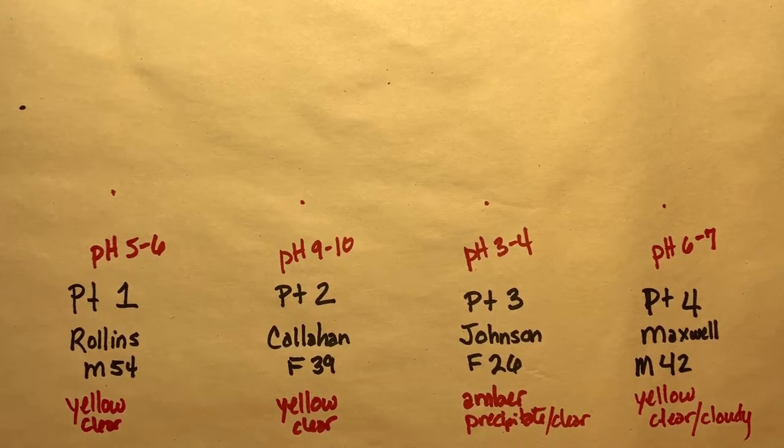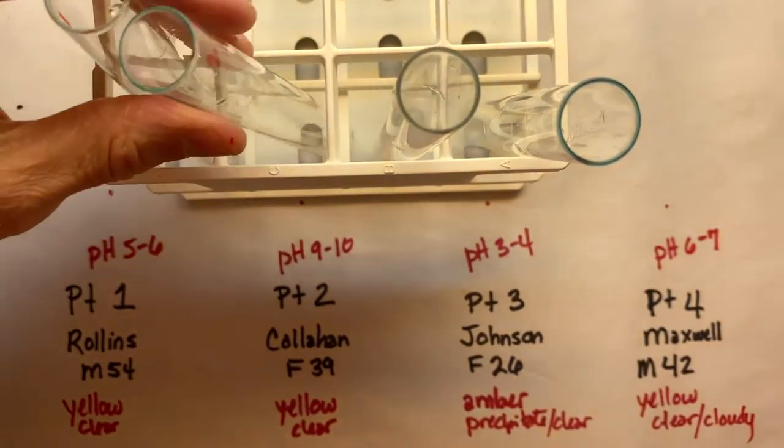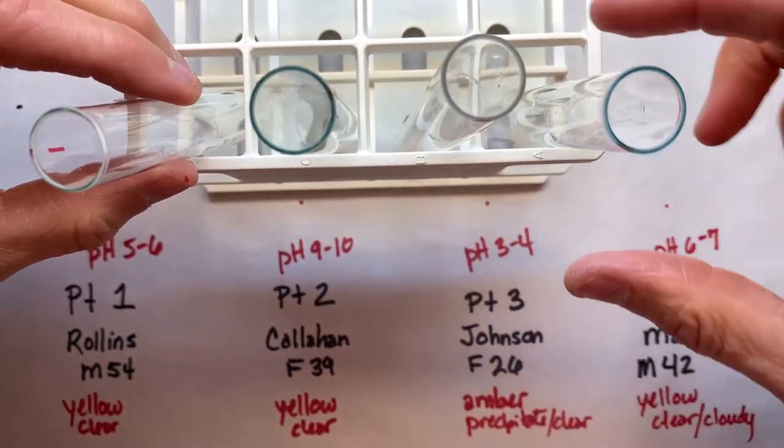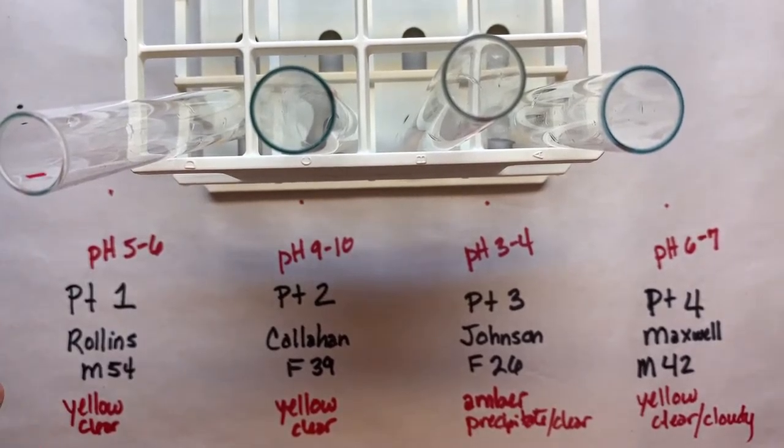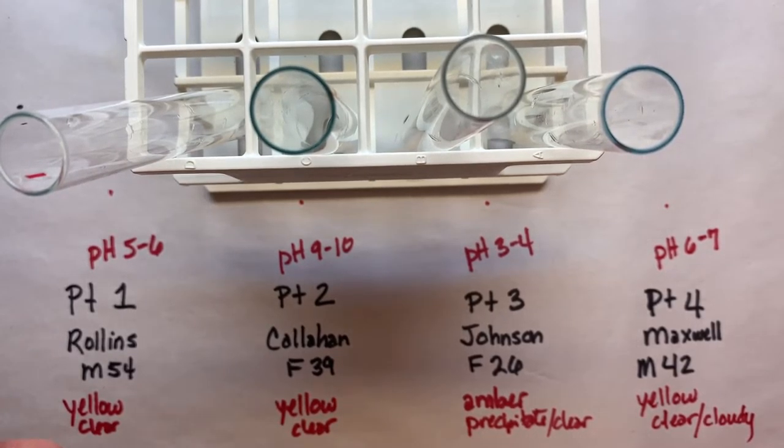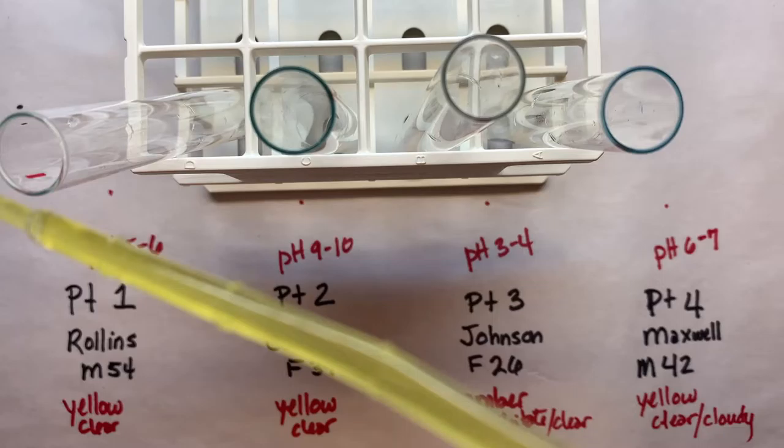So let's get our rack of test tubes, one test tube for each of these patients. The test tubes are numbered. Let's go ahead and add the urine from each patient into our test tube.